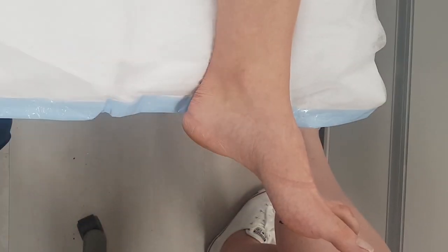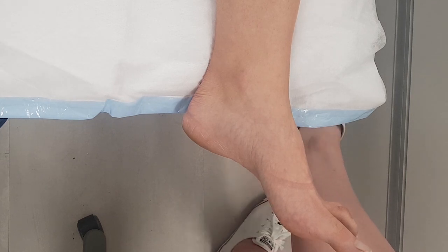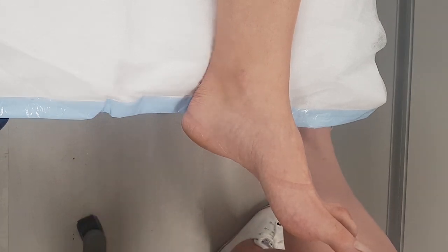And we're just going to go straight in. Now the artery's there — if you go through the artery, there's no reason to aspirate, because the pressure in the artery is going to be higher than the syringe. It will fill up with blood all on its own. If it fills up with blood, you're either going to advance a little bit more and wait for the blood to stop, or take it out a bit. If it fills up completely and you can't see any more coming in or out, you've got to ditch it and do it again. Tell the patient it's completely normal — you have great blood flow.